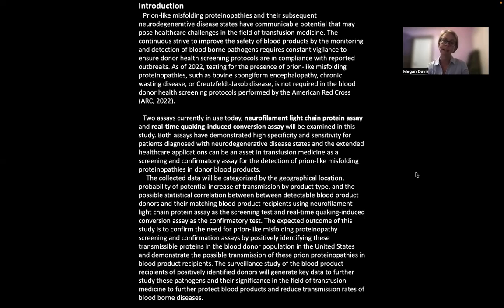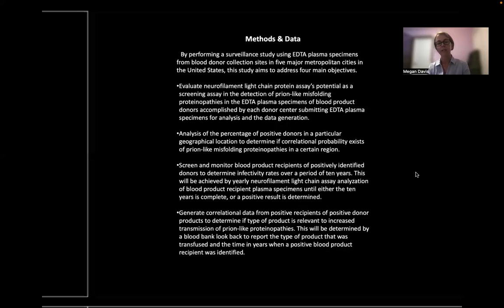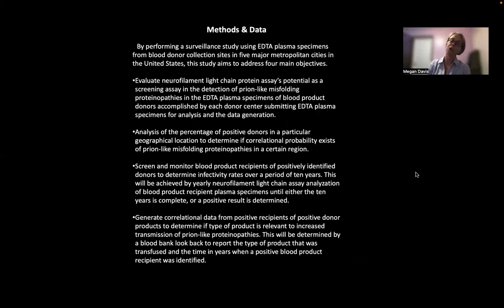Both of these assays have demonstrated increased sensitivity and specificity of greater than 95% confidence limits. The study will be broken down into three distinct phases. Phase 1, screening and confirmation. Phase 2 is going to be recipient monitoring, and phase 3 will be product data analysis.